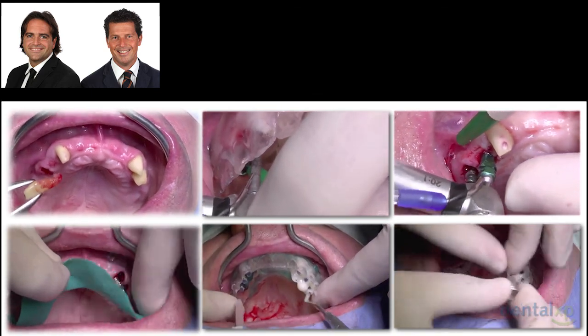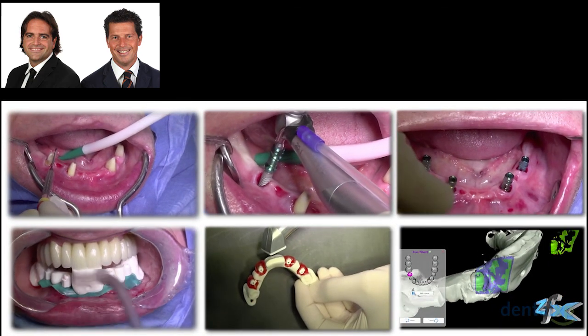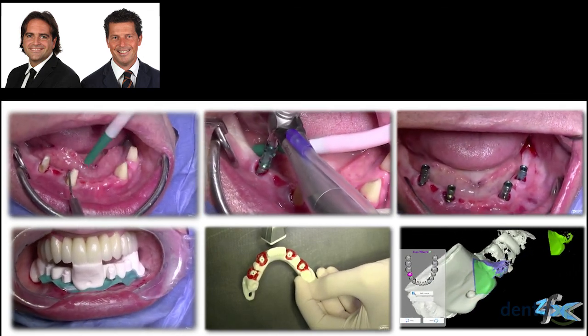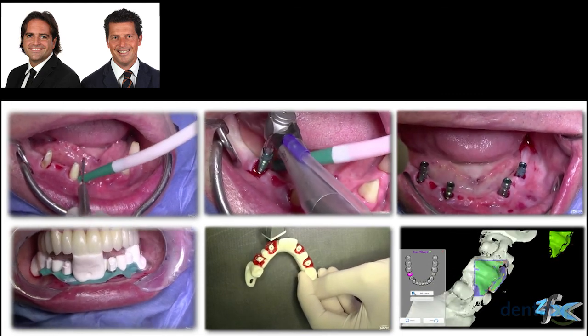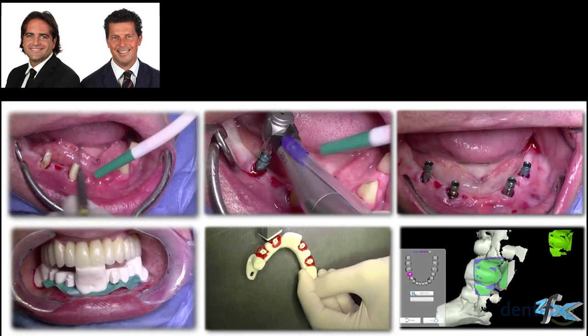And we compared it with the lower arch, where after the surgery of this immediate post-extractive implant placement, thanks to this digital transfer plate, we digitally transferred the implant position to our dental technician, who put that in the CAD software.